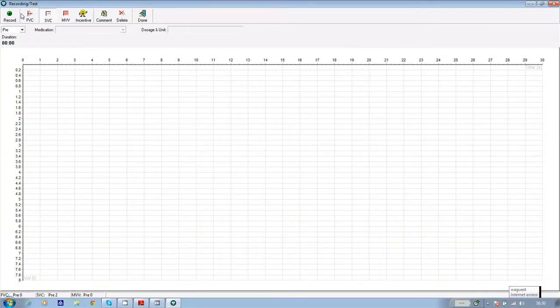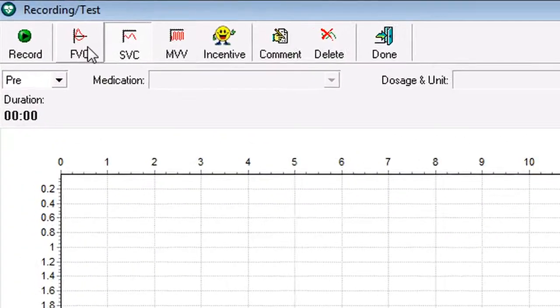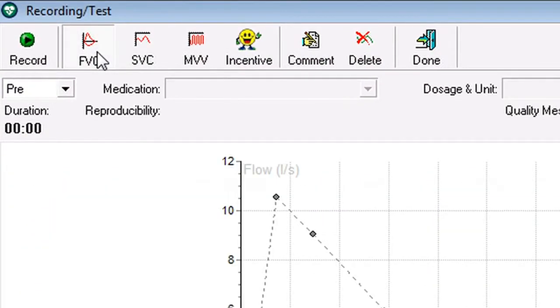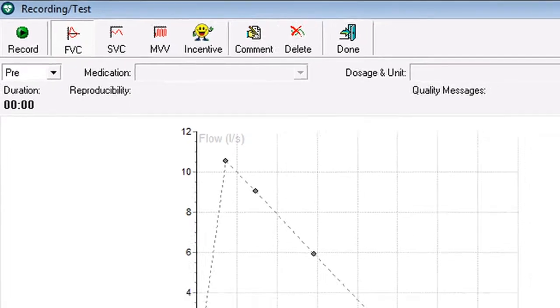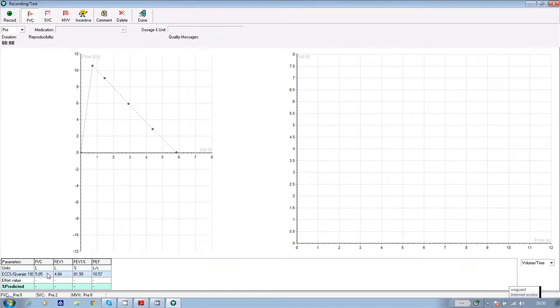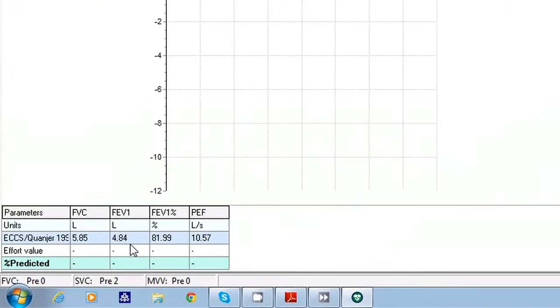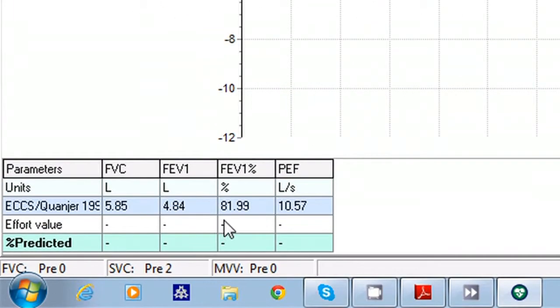Now click on the FVC tab. In the bottom left hand corner of the screen, you'll see the predictive norms for the patient based on their age, gender, ethnicity, etc. for FVC, FEV1, FEV1%, the ratio, and peak flow.